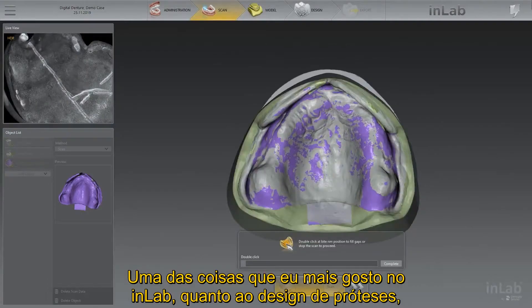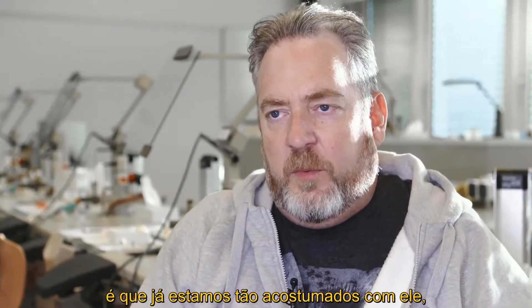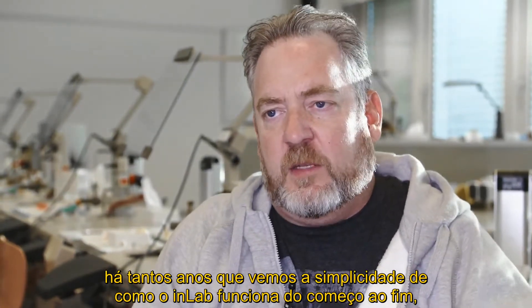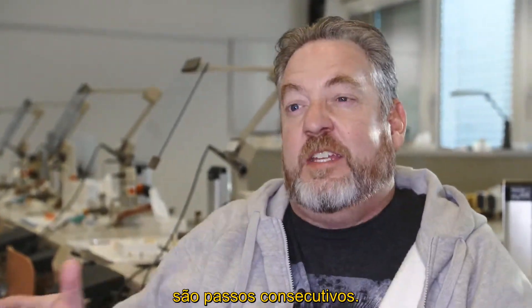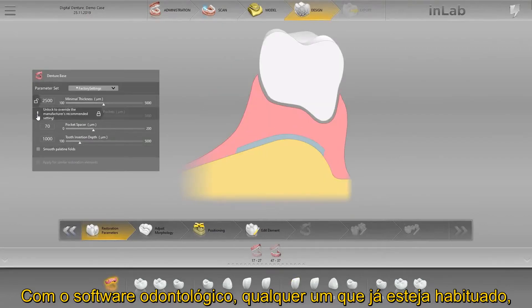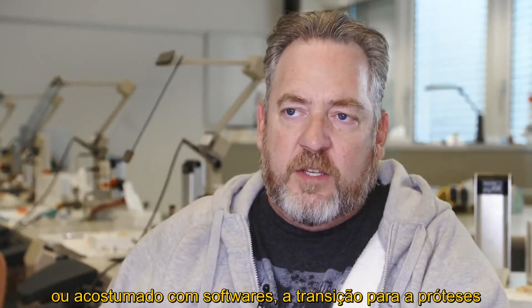One of the things I like about the inLab 20 software when it comes to designing dentures is that we're already so used to it. For so many years we've seen the simplicity of how inLab works from start to finish — it's more or less next, next, next. For anybody already doing All-on-Fours or using the software, the transition to doing dentures is like a snap of your fingers.